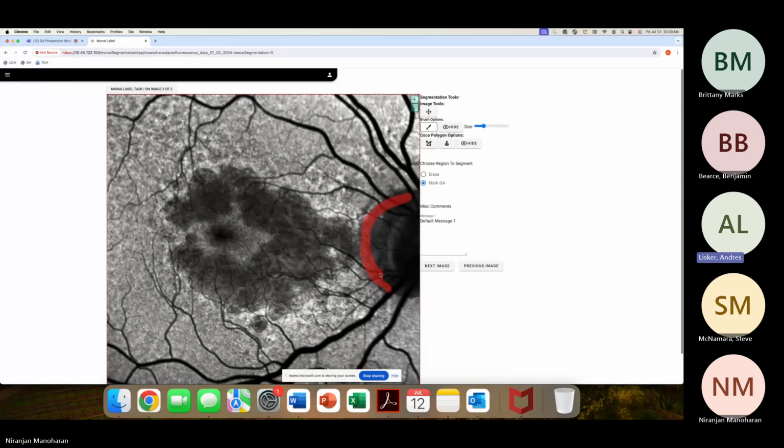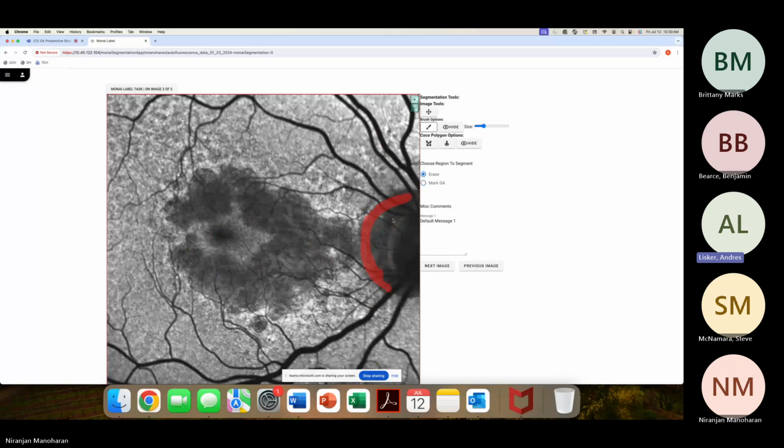No, I did not. I delimited what I believed was PPA and what was GA. But sometimes in these images, it's not as simple, right? It's like an imaginary line you need to create and believe what you think is each one of them, right? The boundaries are not as exact. Right. Yeah.